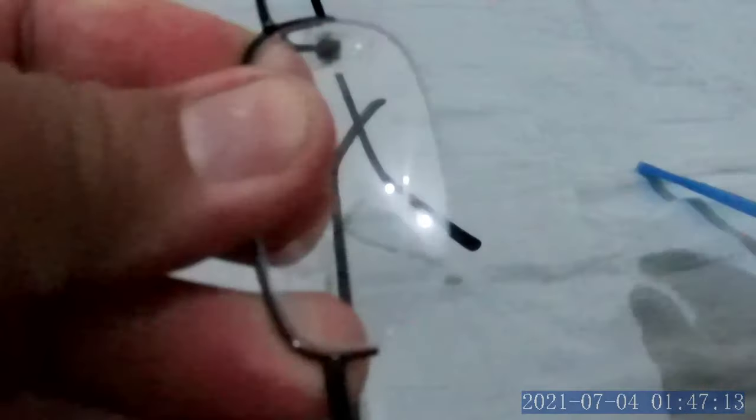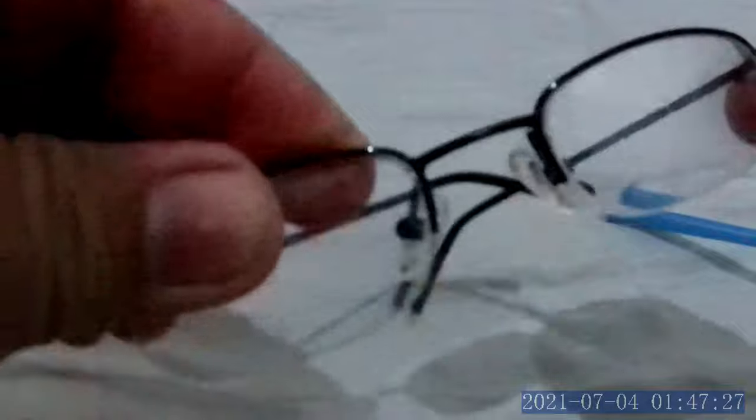Insert the straw down over the string, hold the string, then pull it according to the shape of the frame. Once you can see the nylon is sitting on the lens, pull the straw away. Do the same on the other side — insert the straw on the nasal part and temple part, pull the string all the way through, and once it's seated properly, pull the straw out. That's it!